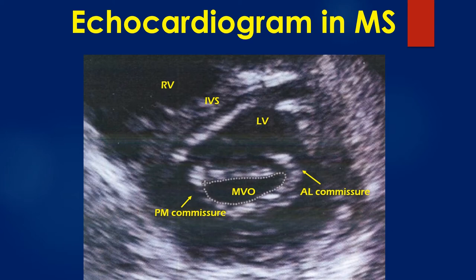Ideally, the smallest full circle should be taken to planimeter the valve area. If it is not a full circle, the subvalvar pathology may be measured as the valve orifice. If the smallest full circle is not taken, it will represent the valve proximal to the severest stenosis, i.e., the valve belly.